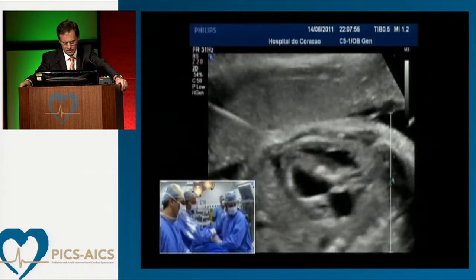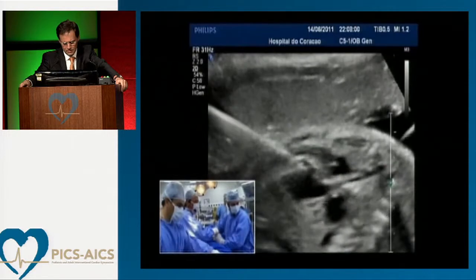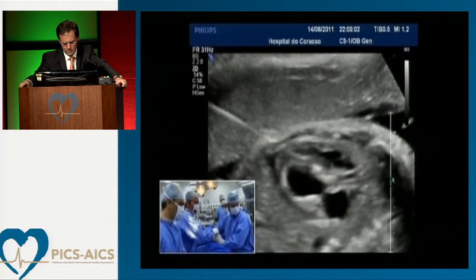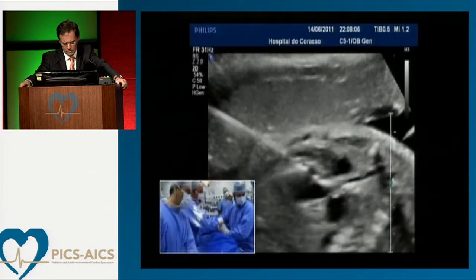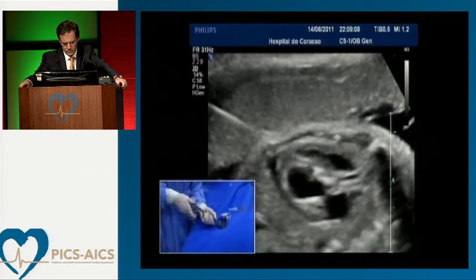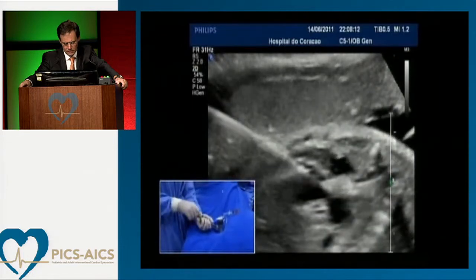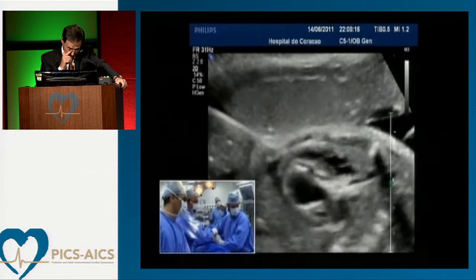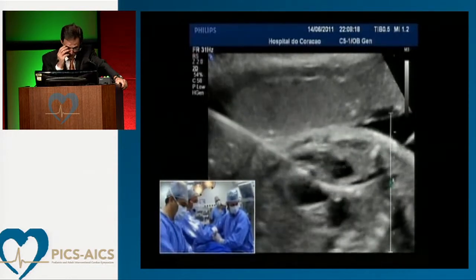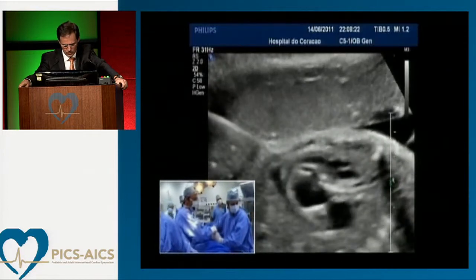right? With 14 atmospheres, we reach 4.2 millimeters. Remember, the annulus measured 4. Let's go again. Put up the balloon. Go again. There you go. One can see. Put it down. Good. So now, as a unit, we're going to take everything out, but not now.